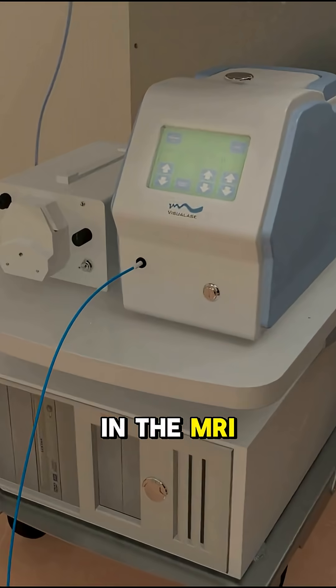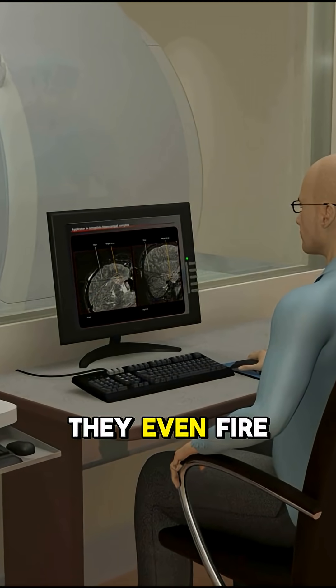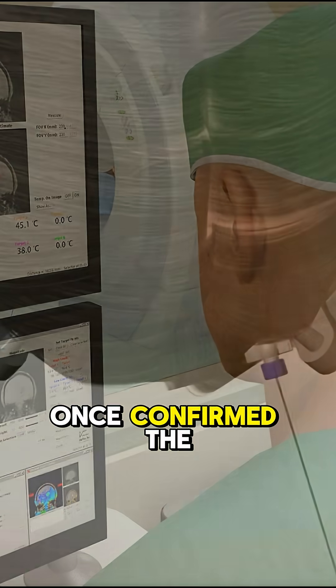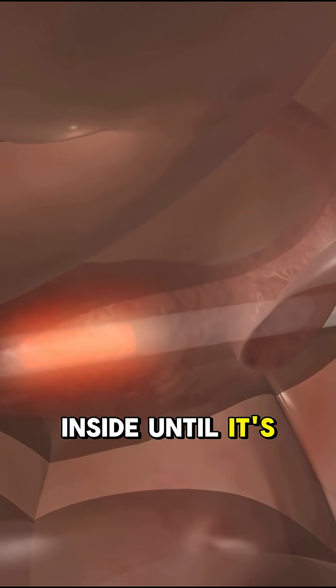With the patient in the MRI, doctors double-check the laser's position. They even fire a low-power test pulse just to be sure it won't hit anything it shouldn't. Once confirmed, the full-power laser kicks in and heats the tumor from the inside until it's gone.